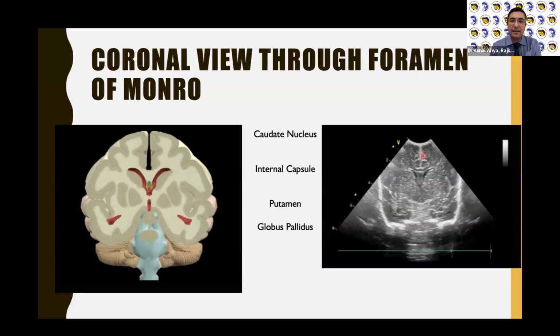This is the interhemispheric fissure. Now here you can appreciate the double line or the rail track like pattern. It is the corpus callosum. Then below the lateral ventricle is your caudate nucleus. Then, if you try to remember the theory, there is an internal capsule, that is the less than or greater than sign like structure.